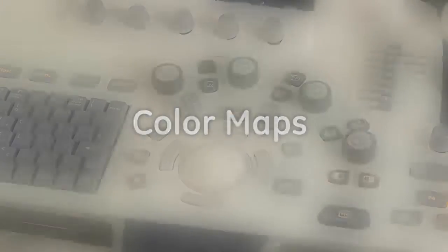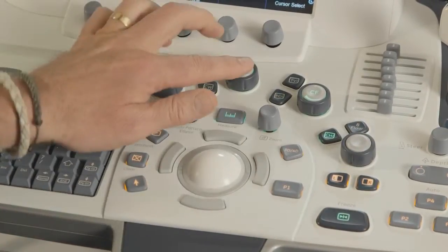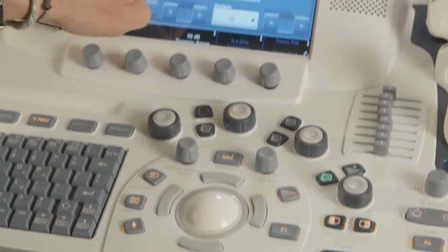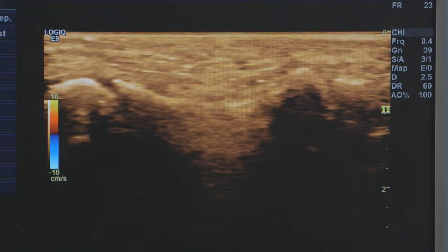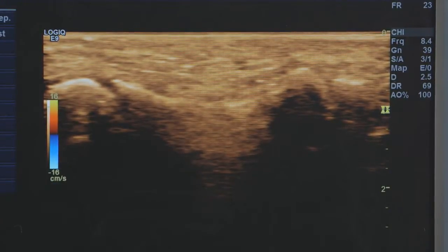Colorize is the colorization of the conventional B-mode image or Doppler spectrum to enhance the user's ability to discern B-mode, M-mode, or pulse wave mode intensity variations. Colorize is not a Doppler mode. Colorize the grayscale image to enhance the eye's discrimination capabilities.